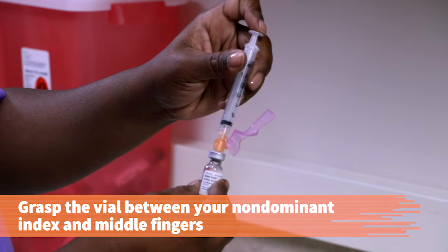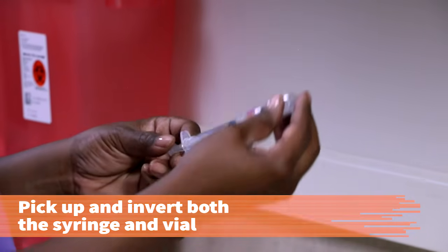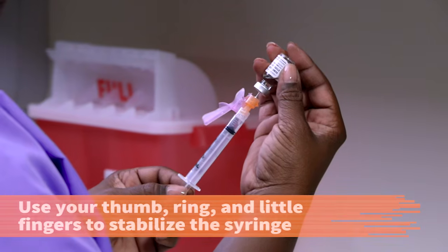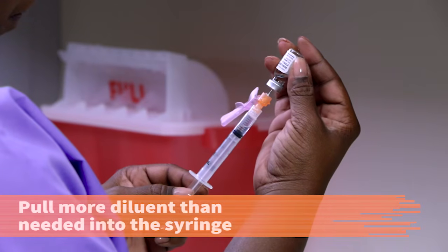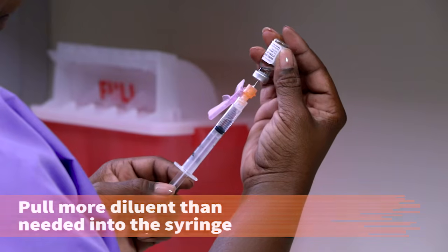With the palm of your non-dominant hand facing upward, grasp the vial between your middle and index finger. Keeping the syringe unit in the vial, pick up and invert both the syringe unit and vial. Use your thumb, ring, and little fingers of your non-dominant hand to stabilize the syringe in the vial. Pull down on the plunger until you have more diluent than what you need.